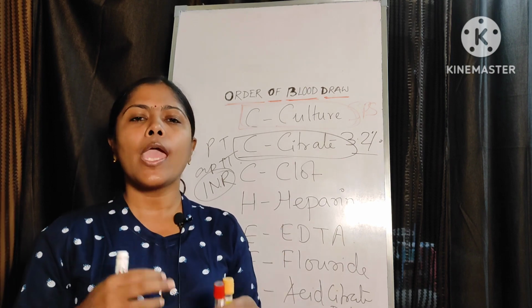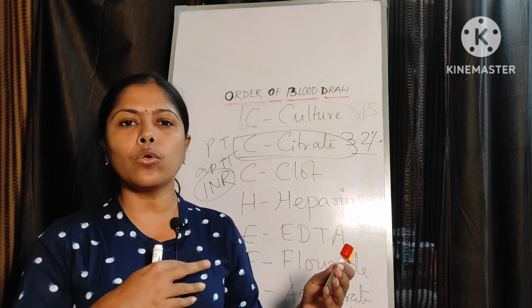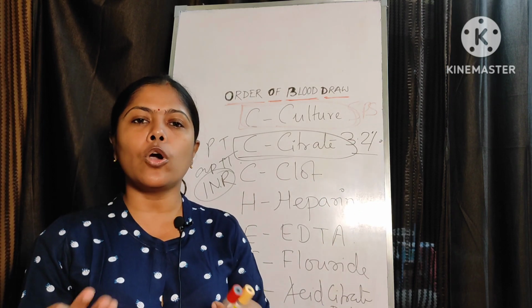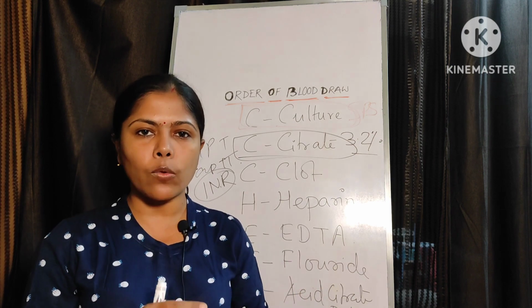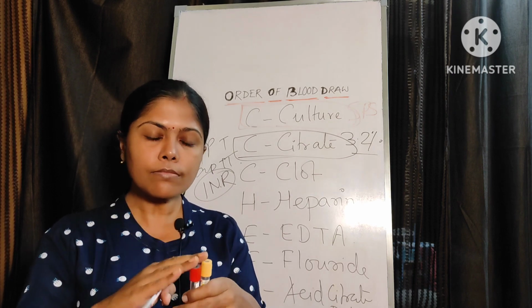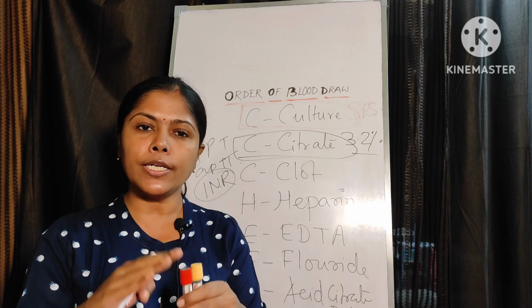It is used in most of the routine chemistry tests that we perform in the biochemical lab: for thyroid hormone analysis, for lipid profile quantification, for liver enzyme assays. We use these clot vials or serum separation tubes.